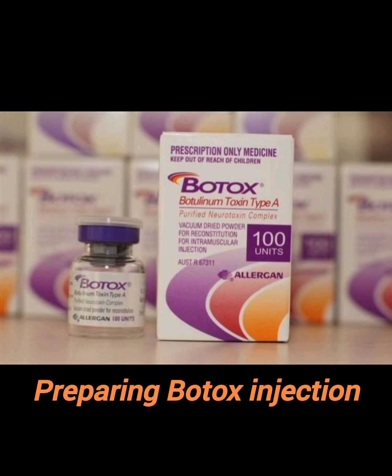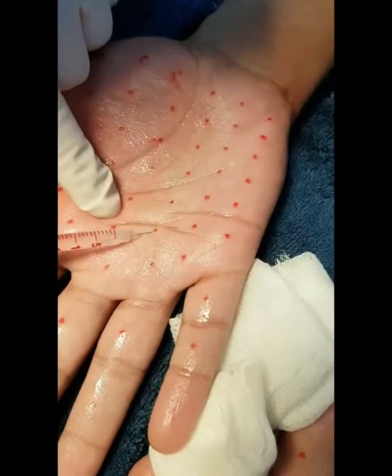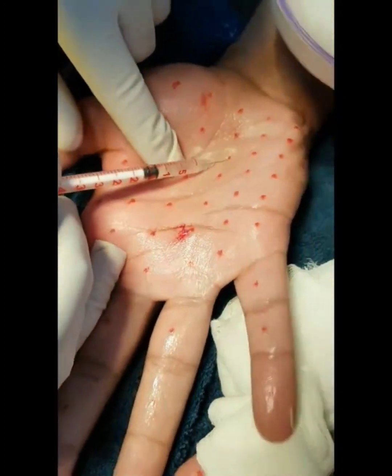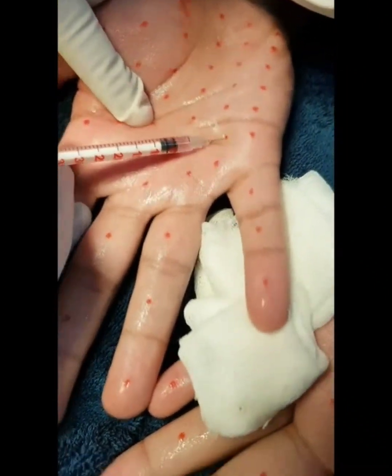The next step is preparation of standard botulinum toxin: 2.5 ml is used and 100 units are made. An ice pack is applied prior to the injection. Once the 100-unit dilution has been prepared, one to two units are given at each point. A vibrator can be placed on the wrist — you can see the hand moving slightly.